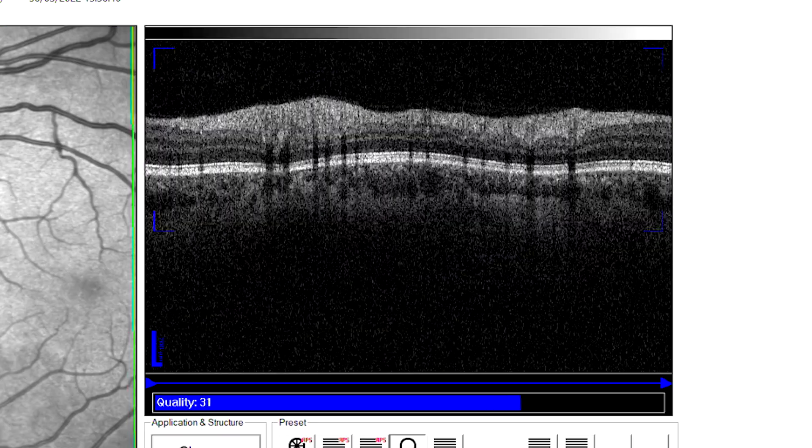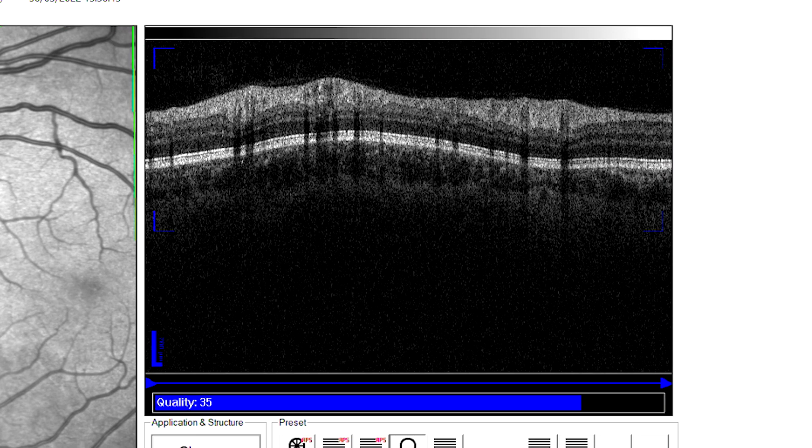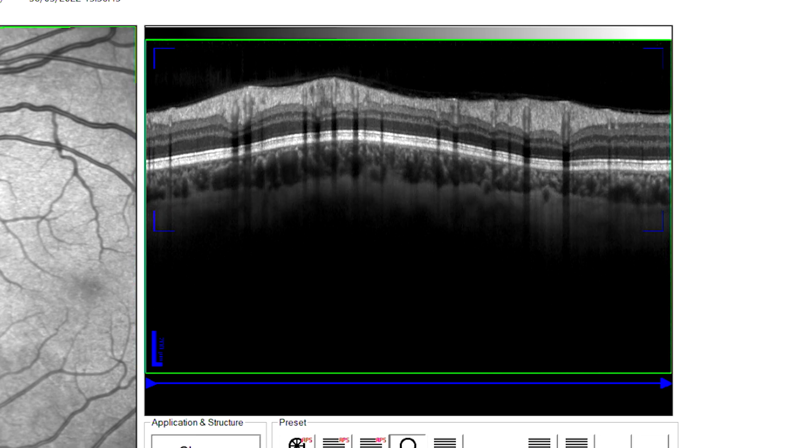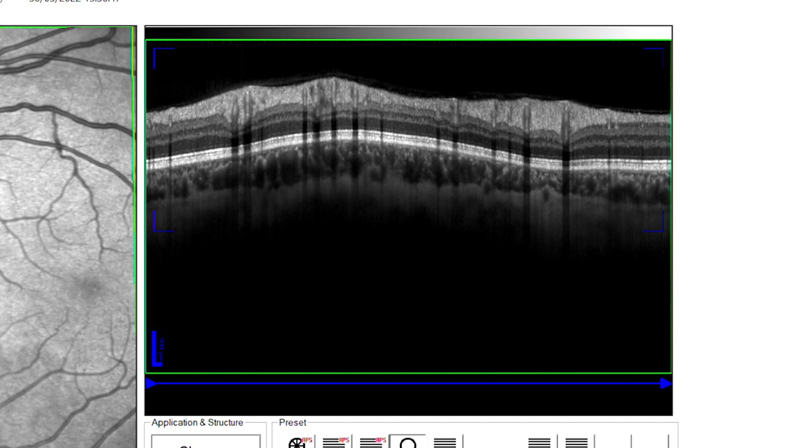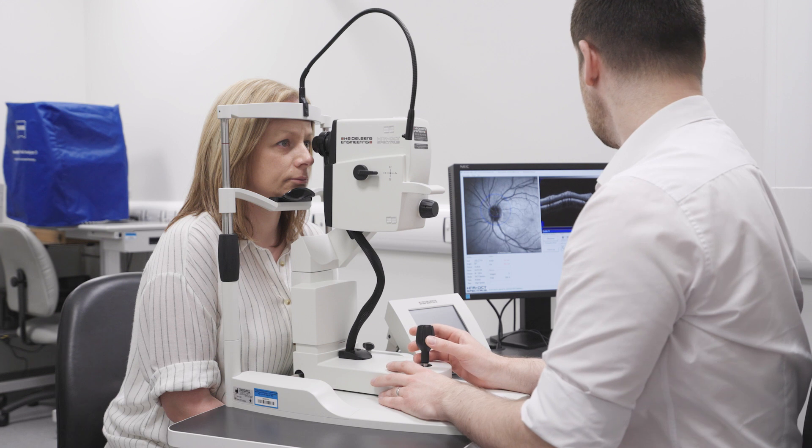Be aware that when adjusting the scan position, the OCT image becomes live whilst the scan is being moved to the correct location. As such, it is important to retain control over the joystick to ensure the OCT image does not move out of alignment.